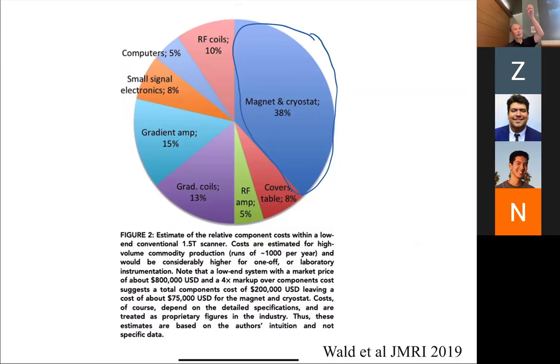So you need a quench pipe. If we had a magnet here, we'd have to have a pipe that would send the helium outside. In this building, they may not allow us to have a pipe just going out the window. You might have to go all the way up to the ceiling, and that would be very expensive if we had to retrofit this room and put a quench pipe in, that could cost a lot of money.